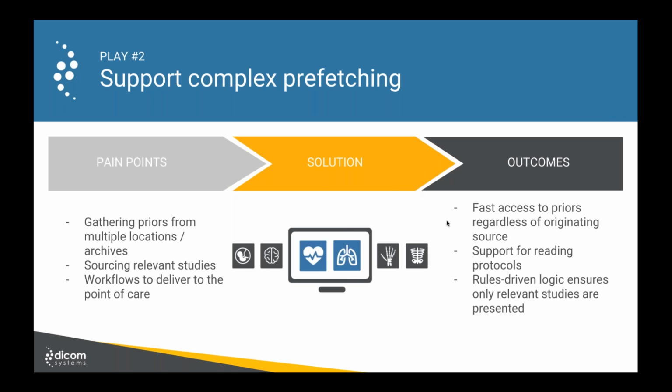Because depending on what PACS you're running, you may have a pricing model that could make it so onerous to bring in and keep those images that you don't want to do that. And so the ability to manage this flood of data, right? In some cases, you might have 10 relevant priors that you're bringing in. And if you're doing mammography, that's going to definitely impact your storage.